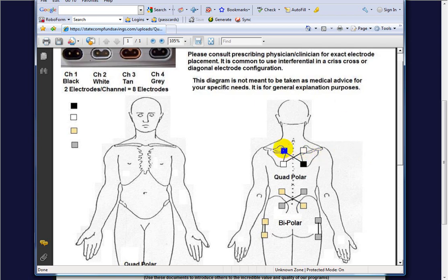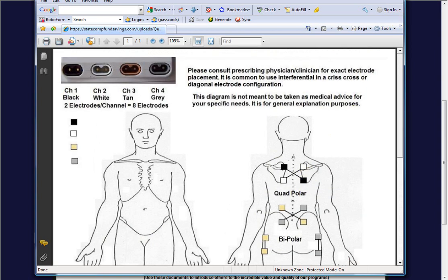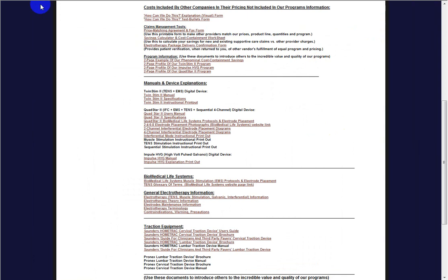So this is how two-channel crisscross interferential works — and then if someone had both upper back pain and lower back pain, they could do two areas at the same time using a 4-channel setup. That's how it kind of works.